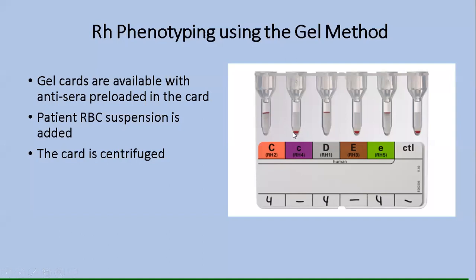So there's no little c antigen. There's a 4+, they're Rh positive, they have big D. There is no big E, and then a 4+ with little e. So we can see that this patient does have at least one type of E, they have little e, and one type of C, they have big C, along with the big D. And so they lack little c and big E.